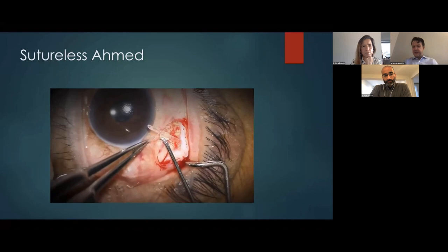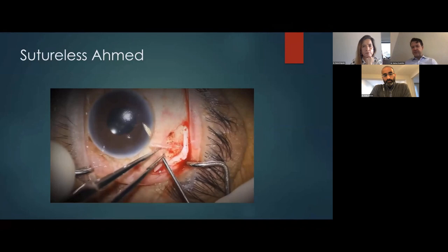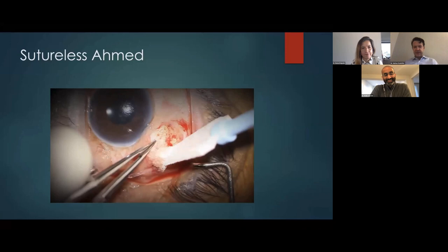I'm coming in. You'll notice I don't make a paracentesis routinely for my tubes. I'm coming at an angle here, and you'll notice I can't cross the pupil with this track. And again, if my tube does slide further in, it shouldn't. And there I'm making your cut, Malik, that you described. Yep. I agree. Very useful. Now I'm getting lucky on this surgery. There's no bleeding. Yeah. So no question why this one made the YouTube series.